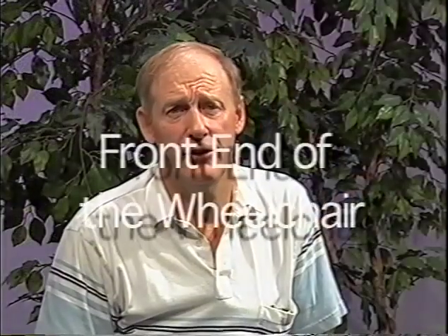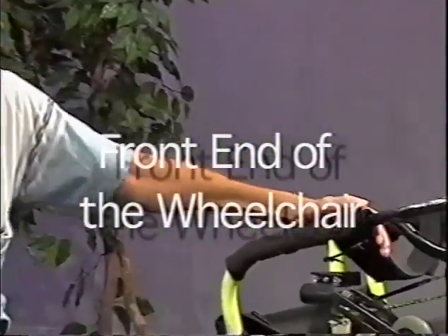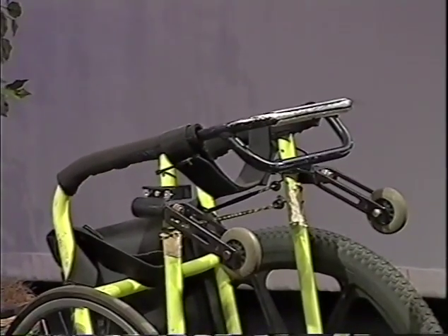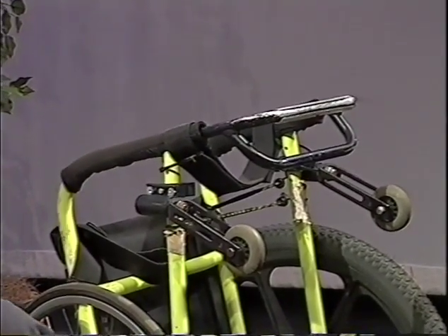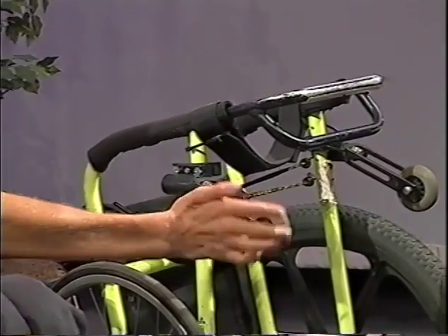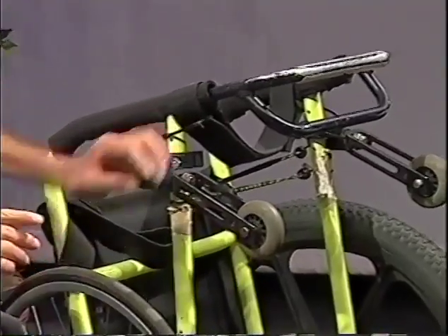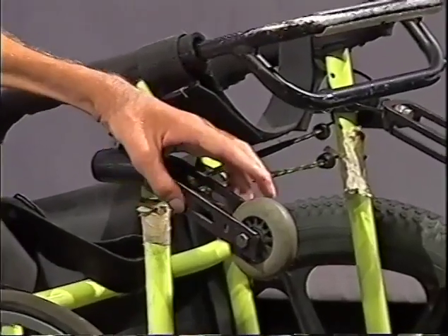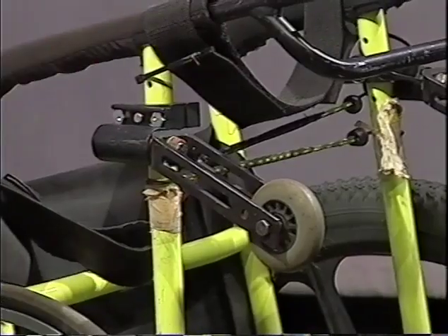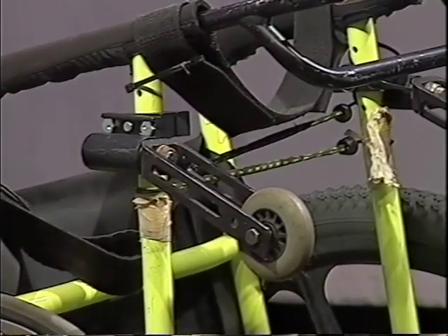Let's take a look at the front end of the wheelchair. When we consider the front end, we want to look at the forks, the type of tire that you're going to use, and how it will be mounted. When you consider the front wheels, you have a variety, from the microcaster, 4-inch, 5-inch, all the way up to 8-inch wheels. And depending on what you're going to be using the wheel for will depend on what you choose.